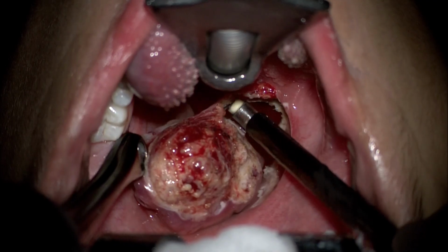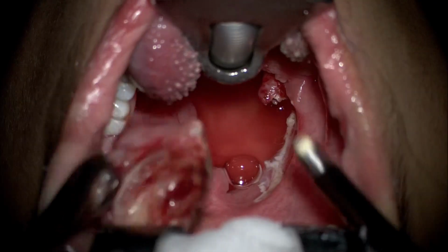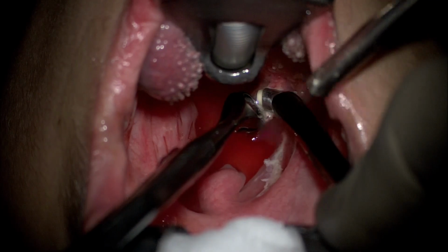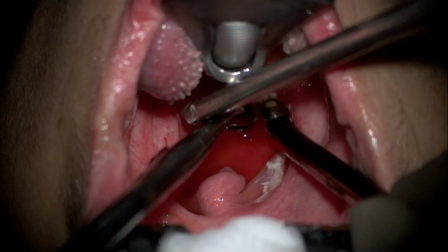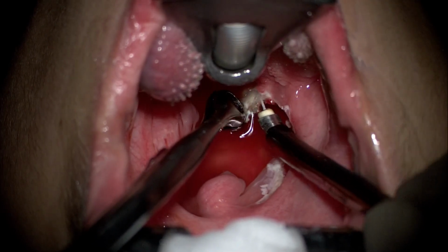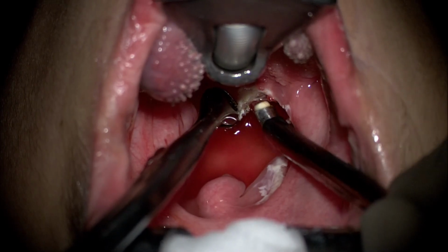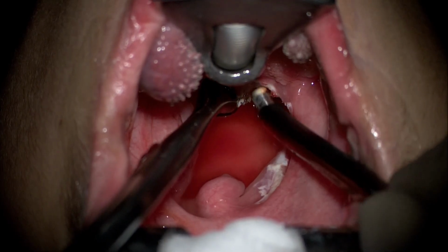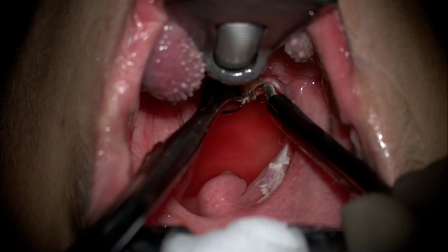The slightest amount of oozing or bleeding can be managed using the coagulation mode, and as you see, a small tongue of tonsillar tissue is still left inferiorly, which can again be safely and easily held and removed using the same coblation device, carefully again avoiding any excess ablation laterally towards the tonsillar bed, because that surely can induce more pain and often incite episodes of secondary hemorrhage.